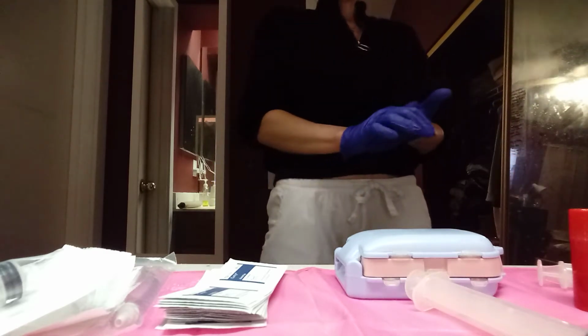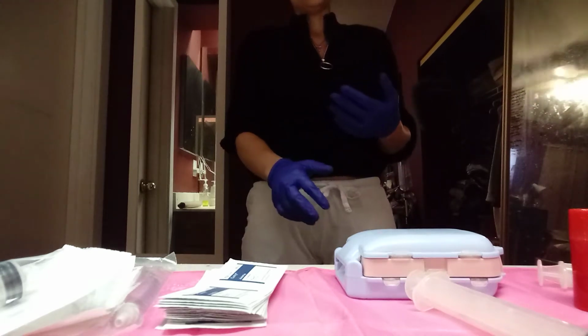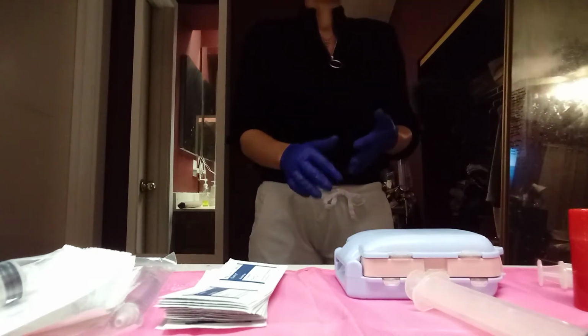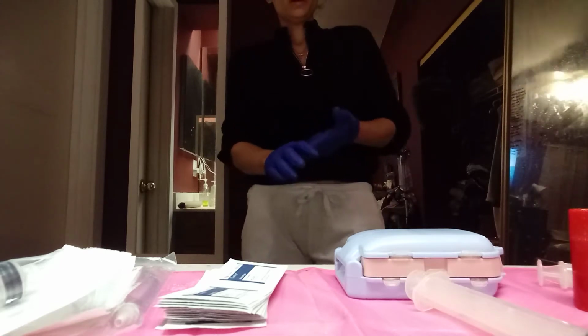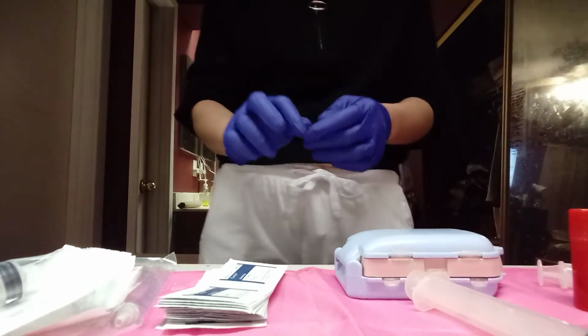I just got a PICC line. I'm getting my new port on Tuesday. So before I did that, I wanted to do a video of how I've been able to not cross-contaminate my line and my feeding tube, because it was really hard to figure out and I was stressed out all the time. So here's what I decided to do.